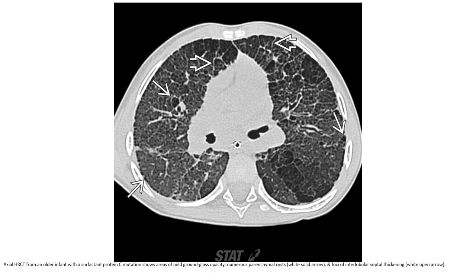This is HRCT from an infant with Surfactant Protein B mutation, showing areas of mild ground glass opacity, numerous cysts, and patchy interlobular septal thickening.